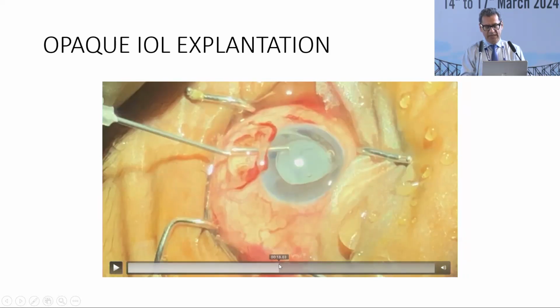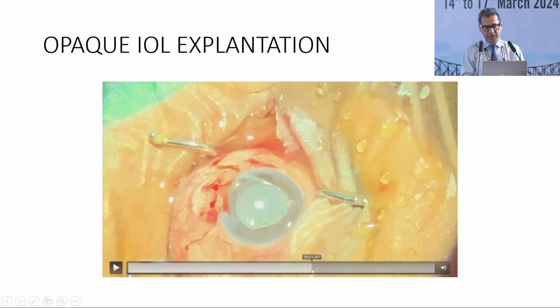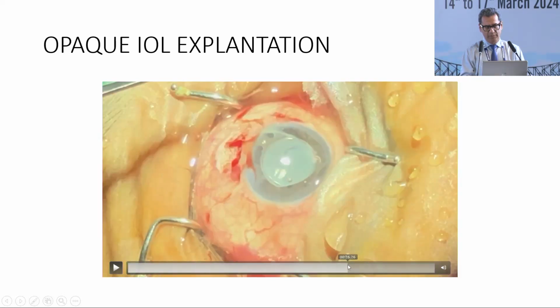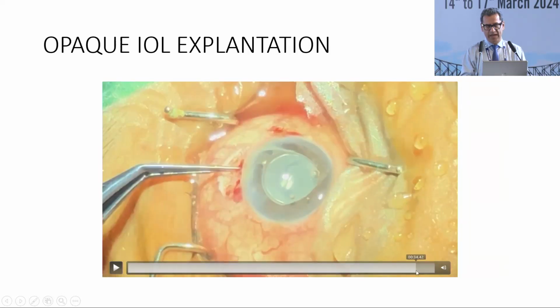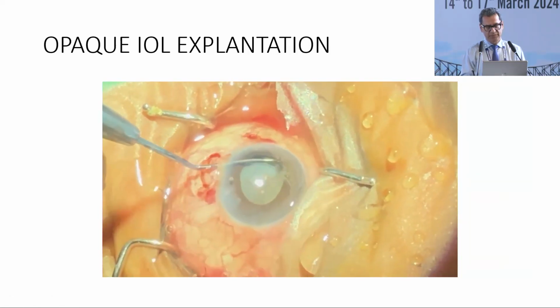So once you get the IOL out, then it comes out beautifully from the wound itself. So there's no big problem in that. And then again, in this case, I inserted an anterior chamber IOL, which gave a very good result in this patient.